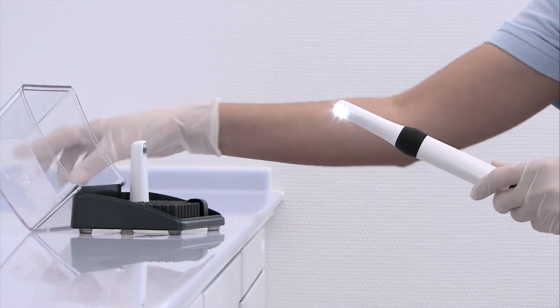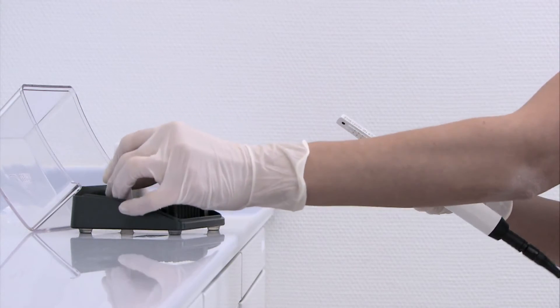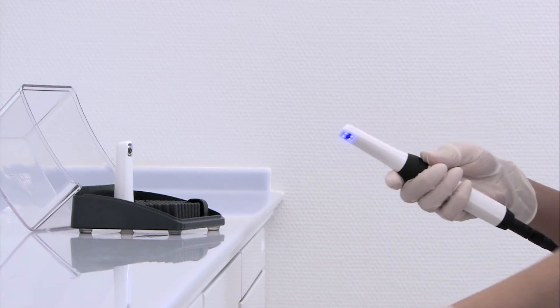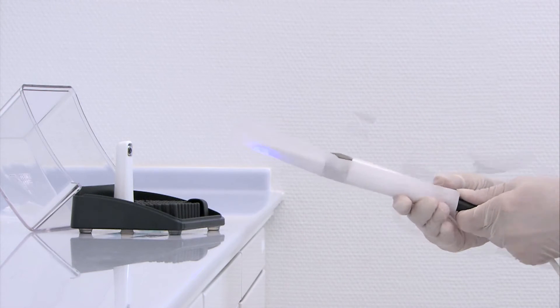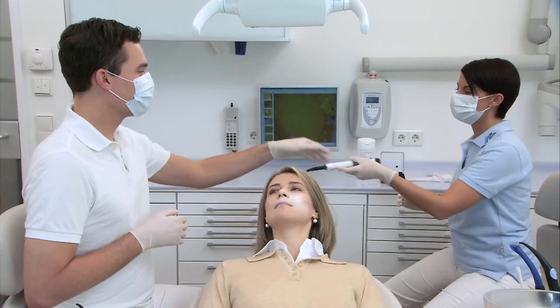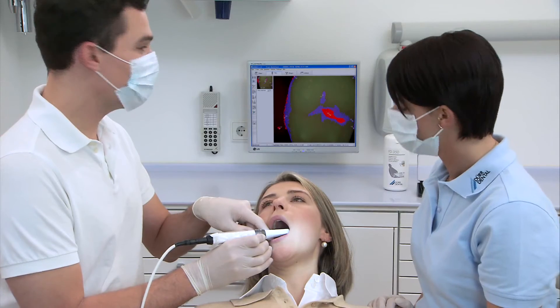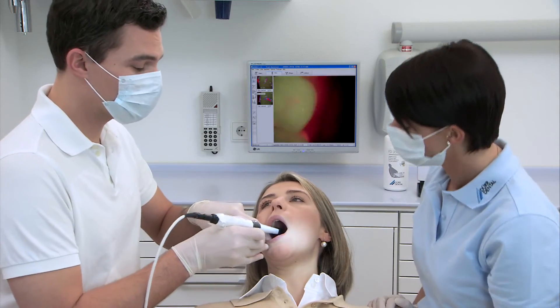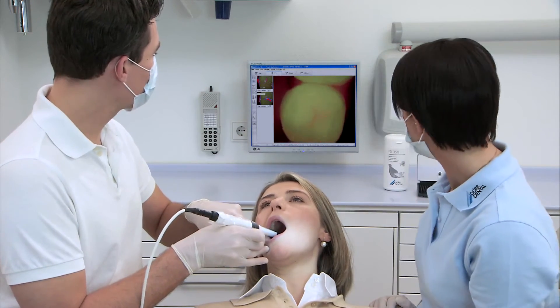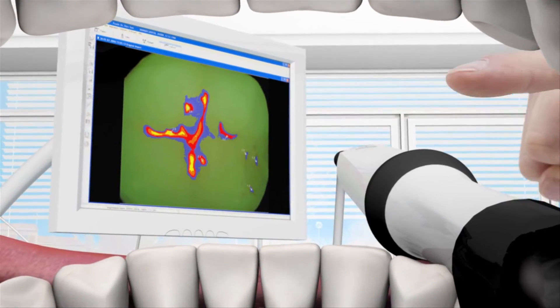Thanks to the practical and unique interchangeable head idea, the Vistacam iX provides intraoral images and at the same time allows for a genuine caries diagnosis. The key to maintaining healthy teeth for a long time is detecting tooth decay early on. The proof interchangeable head makes caries and plaque visible to the practitioner. Metabolic products of cariogenic bacteria are stimulated by the violet light of the LEDs and show up red, which is particularly helpful for areas that are difficult to reach.